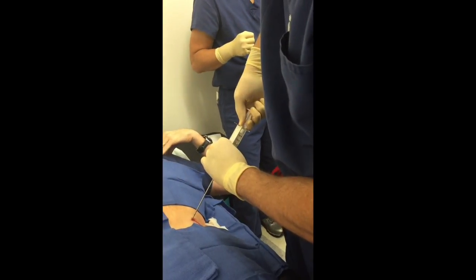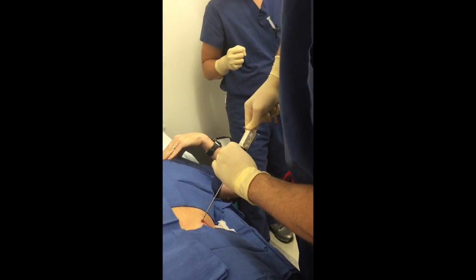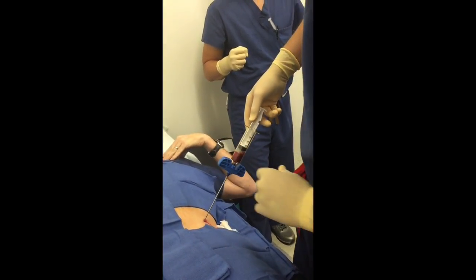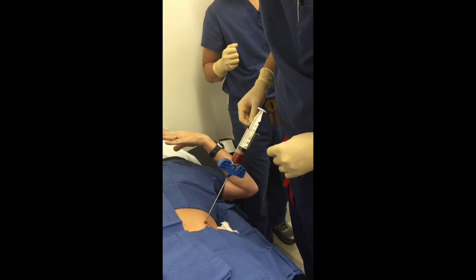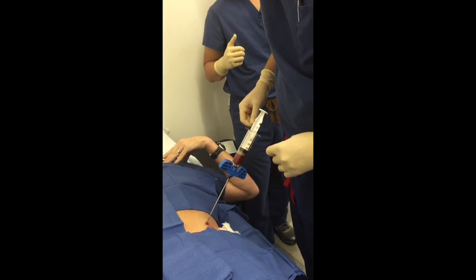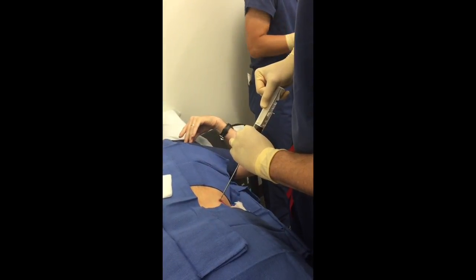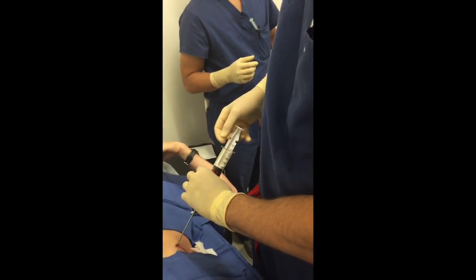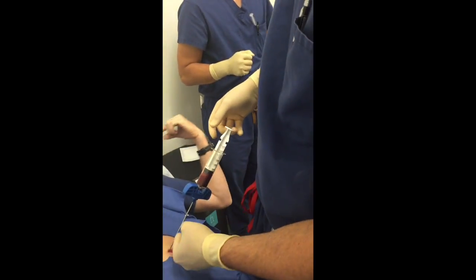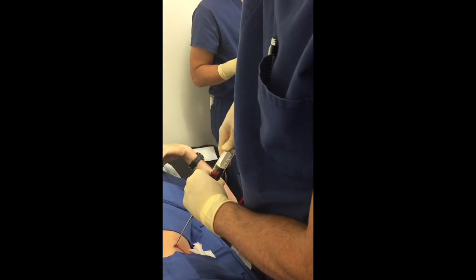It's a little bit nicer just rather than throw it all away. You want to go for more than just 60? I'm game on whatever you can draw out. 60 is good. So when you get to the filter, because it was going easy and it's a little bit harder to get, take the filter and let it filter up. Go ahead and take the red off. See, it might already be clogging.